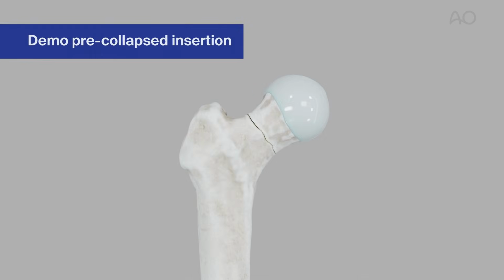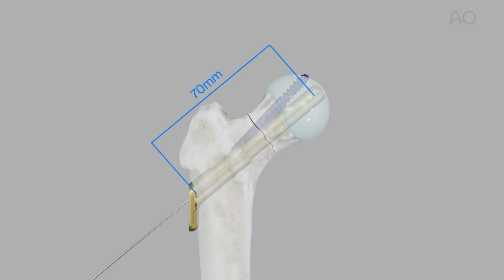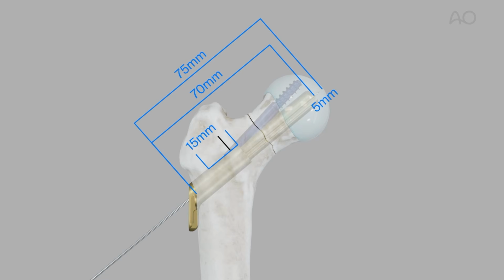This technique is specifically recommended in the case of a patient anatomy which requires an implant length of 70 mm, as the shortest FNS implant length available is 75 mm. Additionally, the maximum sliding distance of the FNS can be reduced by approximately 5 mm, leading to a limitation of the maximum collapse from 20 mm to 15 mm.